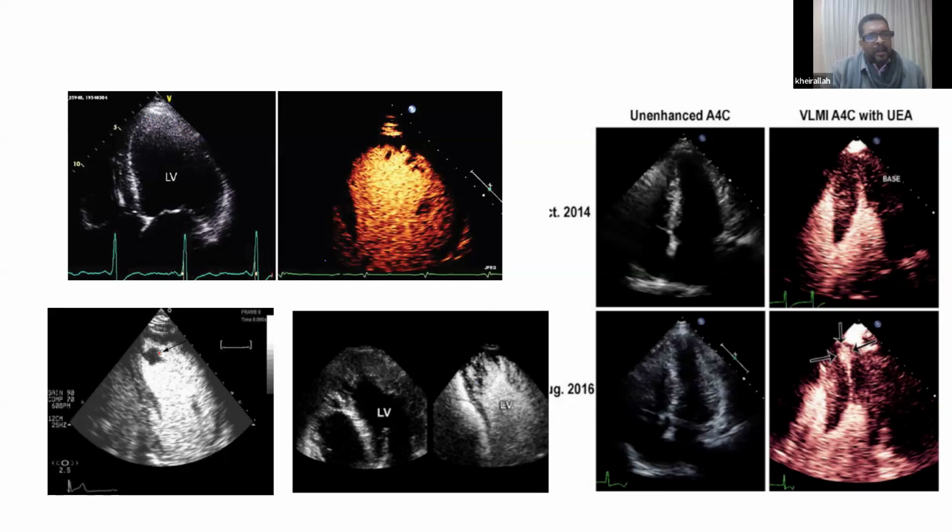In another patient, I see a thrombus, which wasn't seen by plain echo. In another patient, I was seeing something like this. Is this foreshortening or is this stout muscle? I don't know, but when we give the contrast, it shows non-compaction. So deep recesses and trabeculation there.